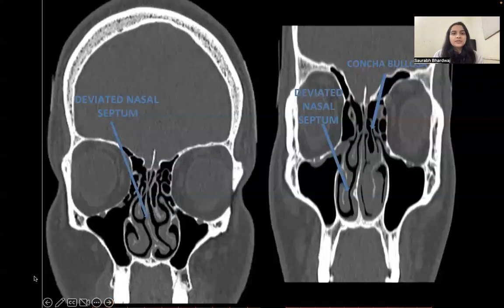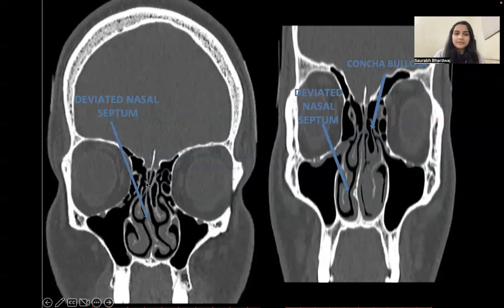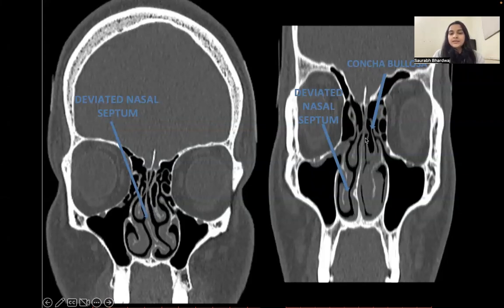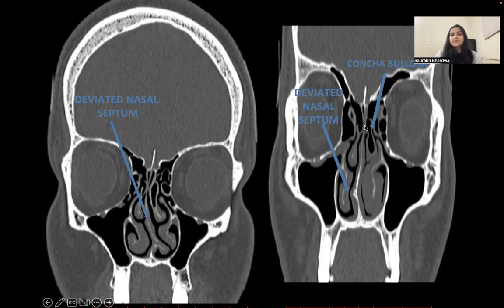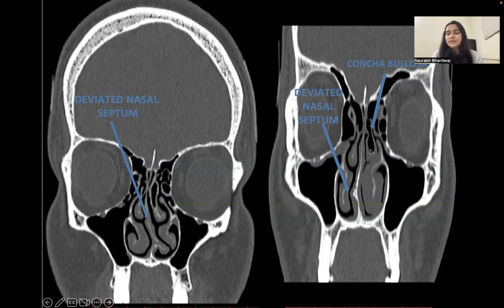This coronal reformat image demonstrates a deviated nasal septum with convexity towards the right side. The image on the right-hand side also shows a deviated nasal septum towards the right side with a bony spur, and there is a concha bullosa seen, which is the pneumatization of the middle turbinate.